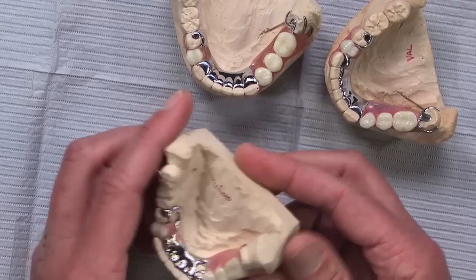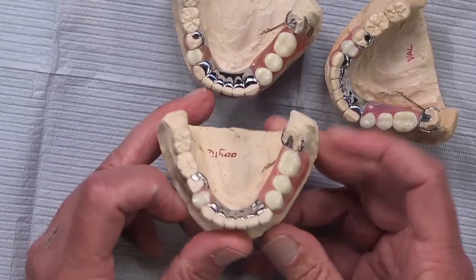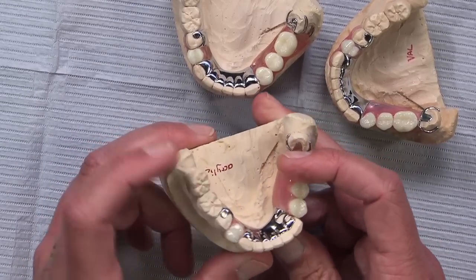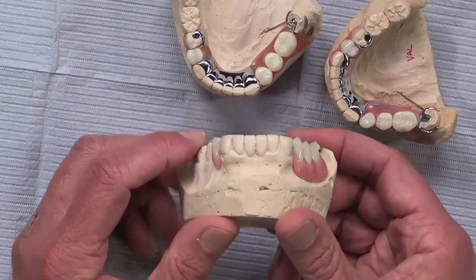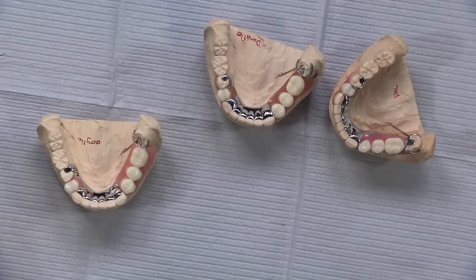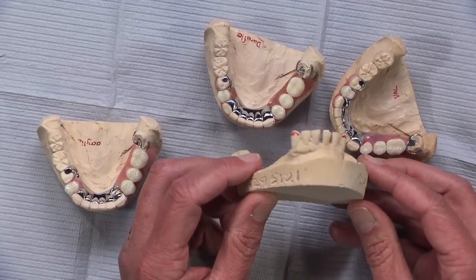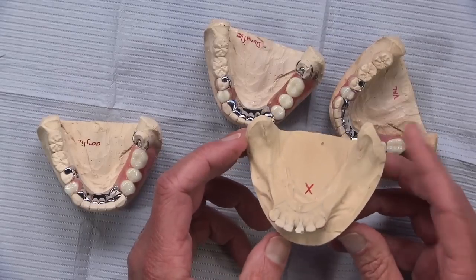And of course, the other nice part about this being tooth-borne and having this rest here is that it's not tissue-borne. It's not going to impinge on the tissue as the patient bites down and dig into that tissue. And here's another model that I grabbed while I was over there. This has been sent in from a dentist to have a lower partial made.